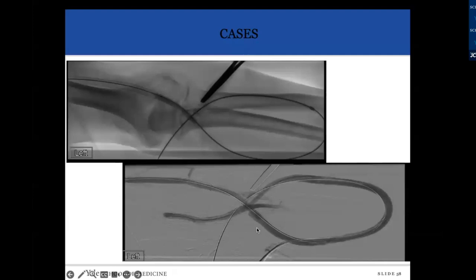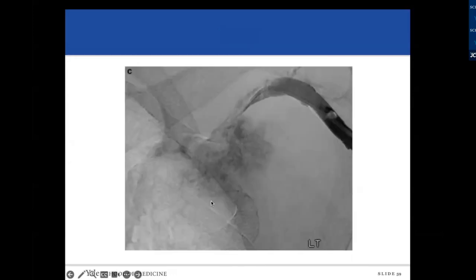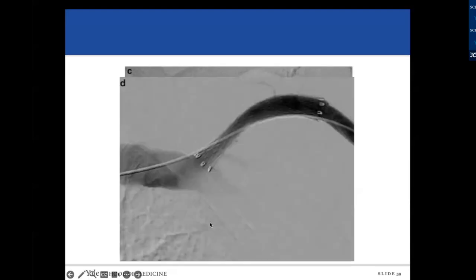And you always want to know what the issue was with the fistula and where the problem is so that you can angioplasty. And in this location, it was the venous anastomosis that was the issue. So things go wrong sometimes when you angioplasty, especially around the cephalic arch or where there's a tight stenosis. And then these are the issues that you get into. You get contrast extravasation once you inject. You can easily fix those contrast extravasations with a stent.